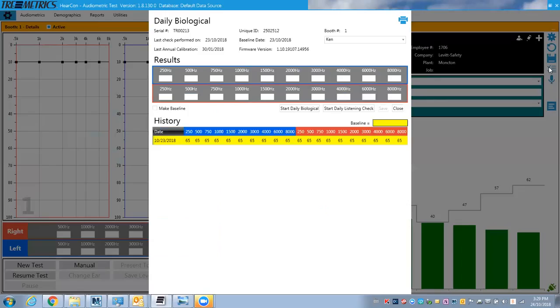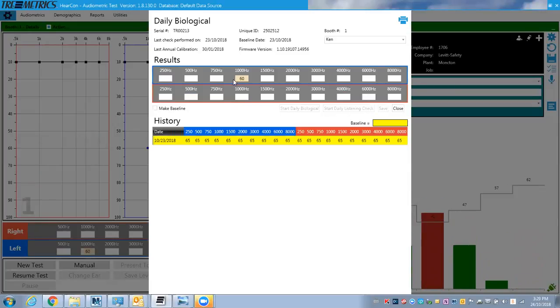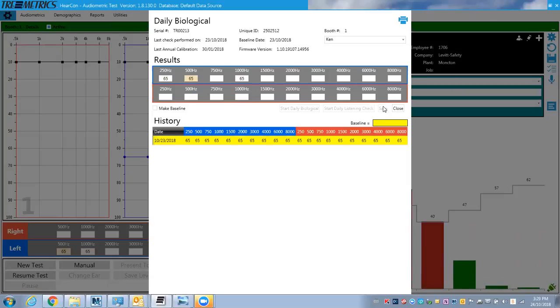We were talking about the daily checks. This is for the daily check, so I can start my daily biological. So now it's sending these tones to the headphones and listening to hear if it's picking them up. So I won't let it go through the whole thing, but you can do this and it records it.